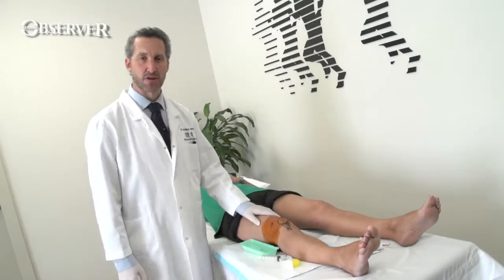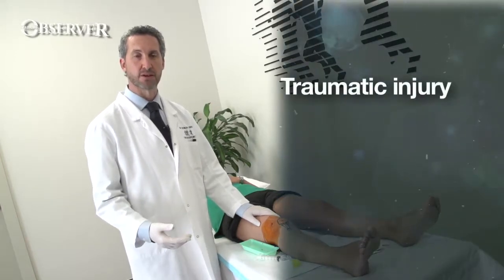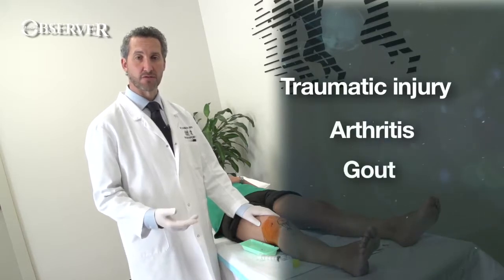If a patient has a large effusion, there can be many reasons for it. It may be traumatic and filled with blood, or they may have some form of arthritis which has created the effusion for them.